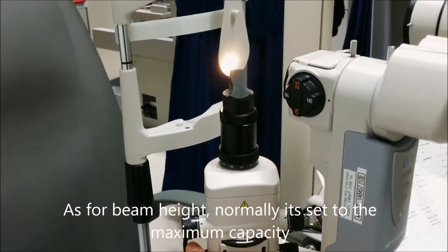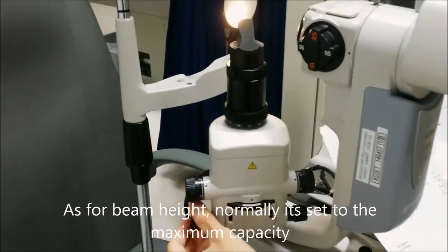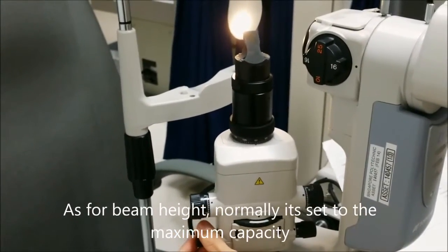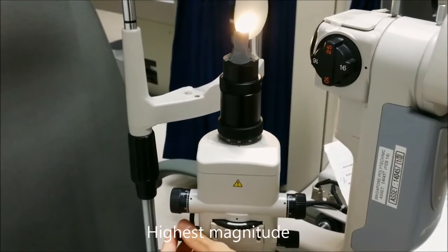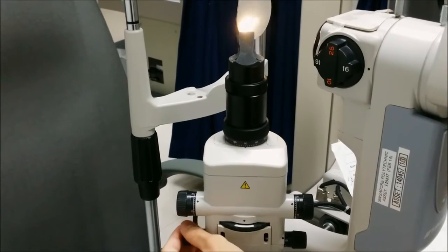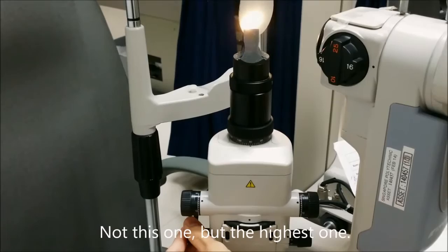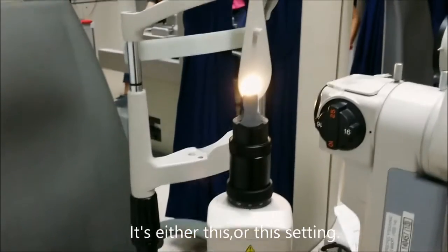As for beam height, it's normally set to maximum capacity. The highest one, not this one but the highest. It's either this or this.